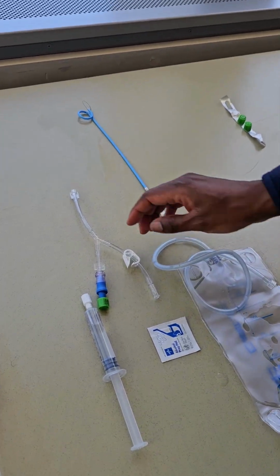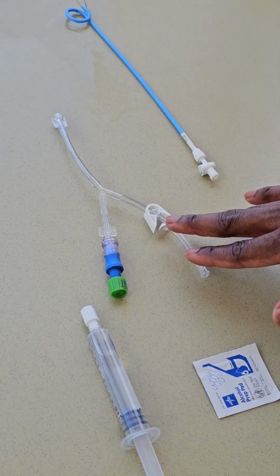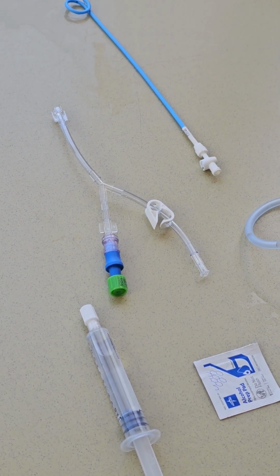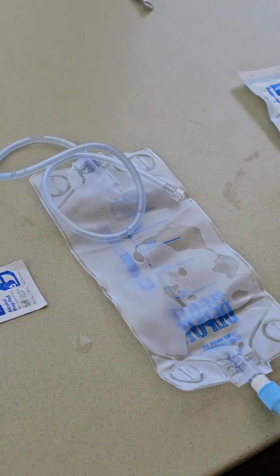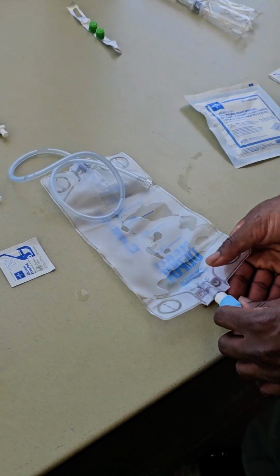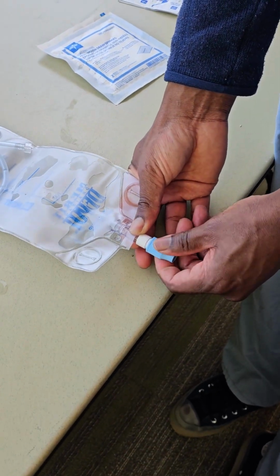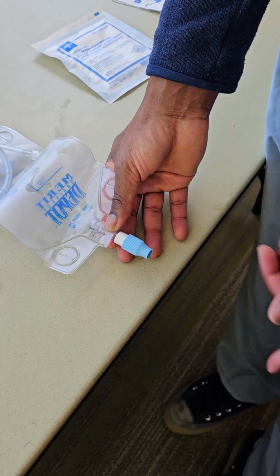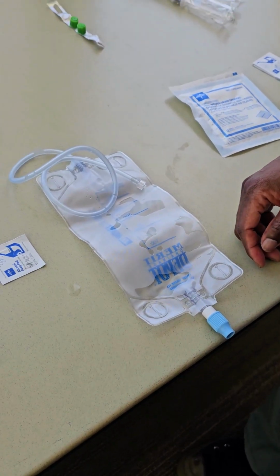The next component is your flushing system. In this particular situation, we have a Y connector type flushing system, and we'll talk about how the patients flush this. And then the third component is your drainage bag. One particular tip for the drainage bag is this port at the bottom of the bag is how the patients will empty the fluid that's in the bag. And so that's one part to troubleshoot when you're looking at the drain.